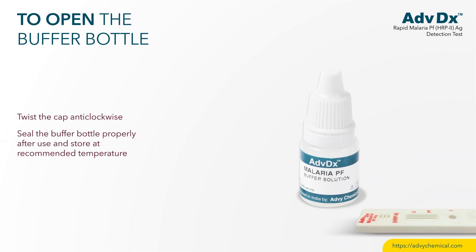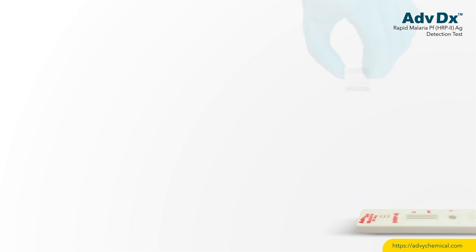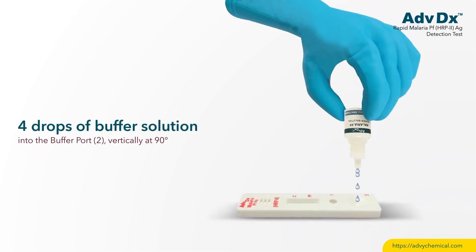Seal the buffer bottle properly after use and store at recommended temperature. Add 4 drops of buffer solution into buffer port 2, vertically at 90 degrees.